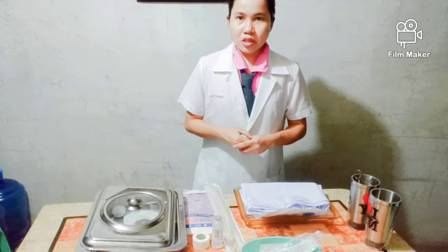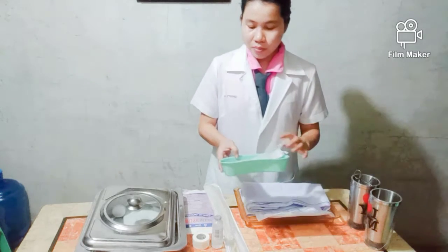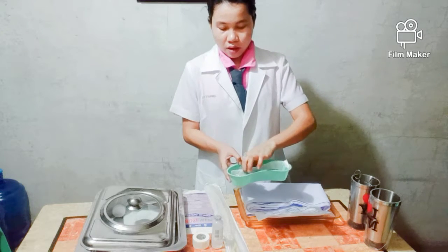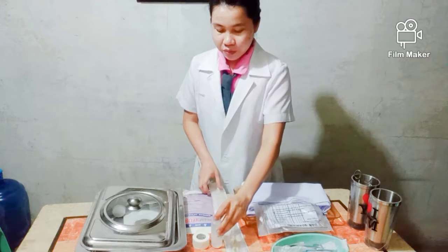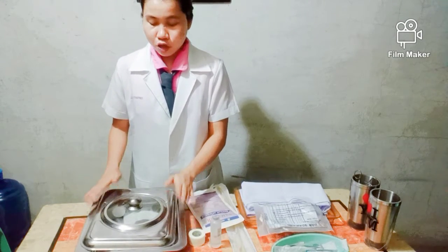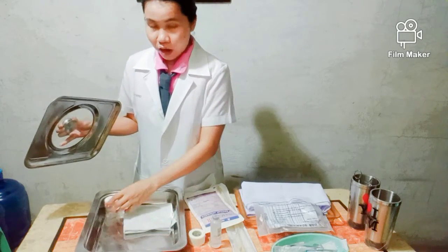But first, we will be preparing all the materials needed, including the linen tray, the bath blanket, the urinary bag, kidney basin, and the syringe with needle, the lubricating jelly, the bandage scissor, the sterile gauze, the catheter, the plaster, the sterile gloves, and the stock tray — which should be sterile. Inside the stock tray we have a specimen container, the drape, and the drape sheets.